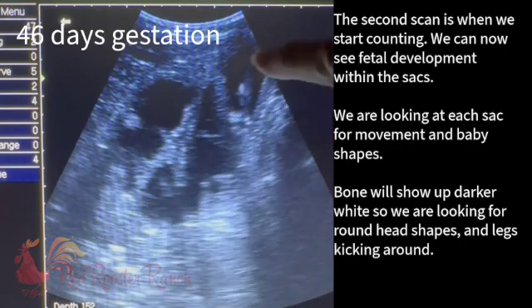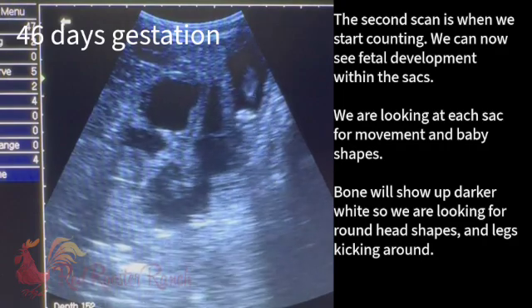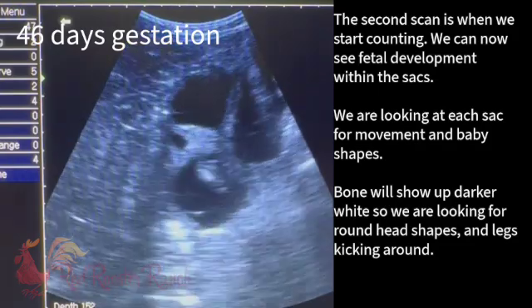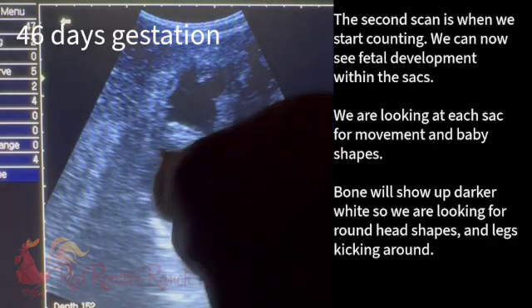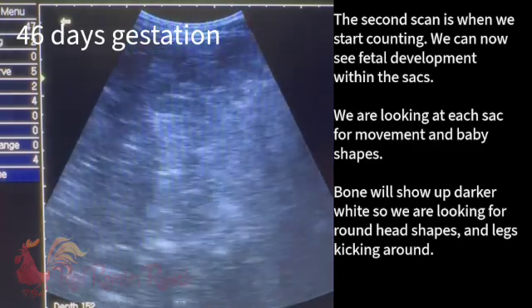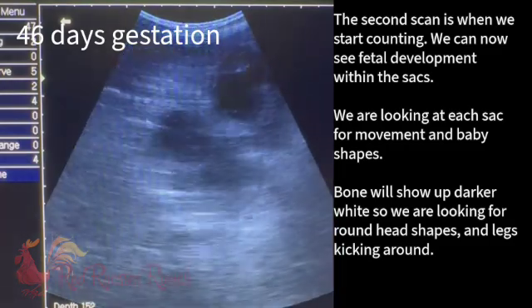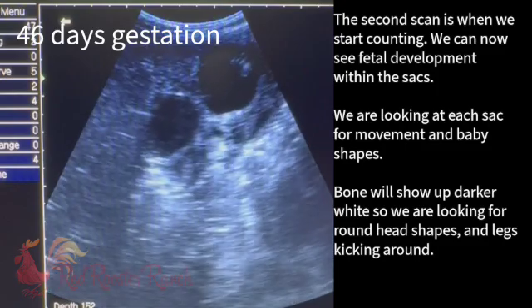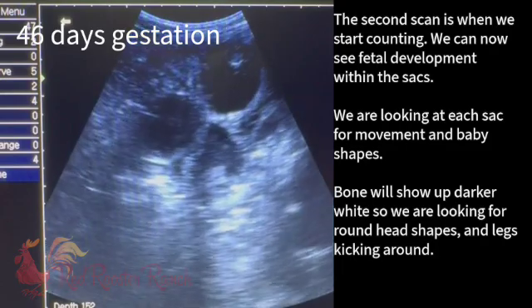It's upside down. There's the head and the body. I'm going to go back to the first baby — I'm doing this with these little slight wrist turns. I'm going to see about that sack again. That sack that I thought I saw something in could just have either a baby that didn't finish for me, or some placental tissue or a cord. It looked like something in there but I never could get a good body shape or movement.